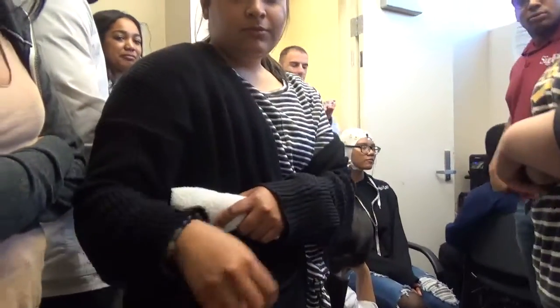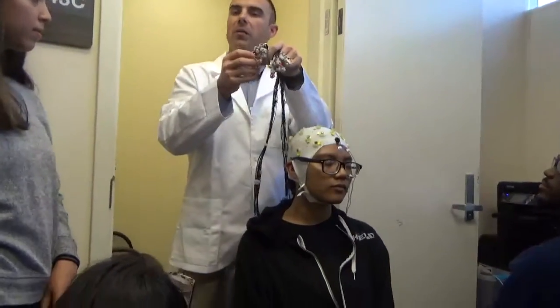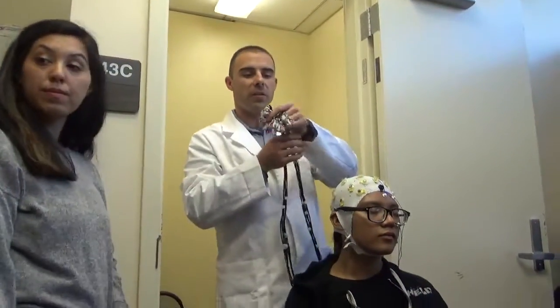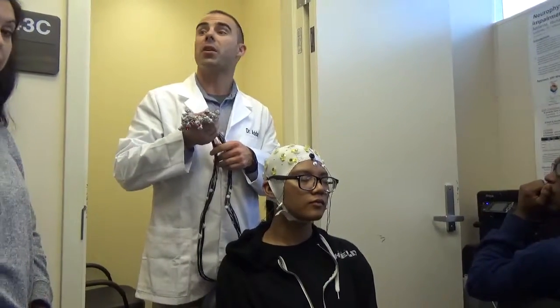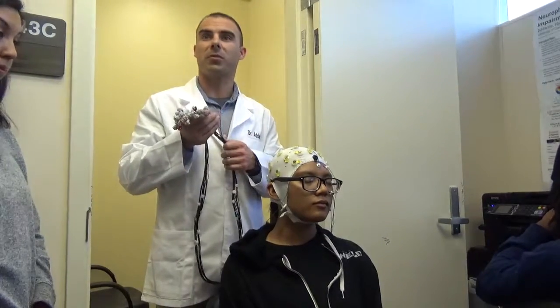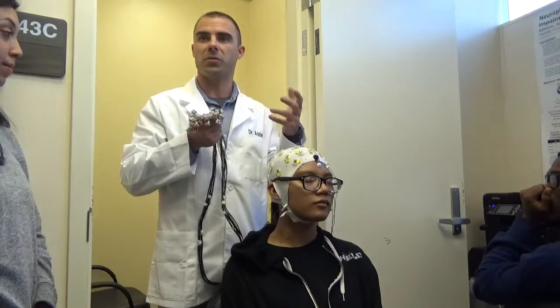So let me show you guys something that happened right off the bat. Look at how these lit up. They're all red now. In this case, red is bad in the sense that they color code how good our impedance measures are. So red is like a stoplight. Red is bad, yellow is kind of in the middle, and green is good.